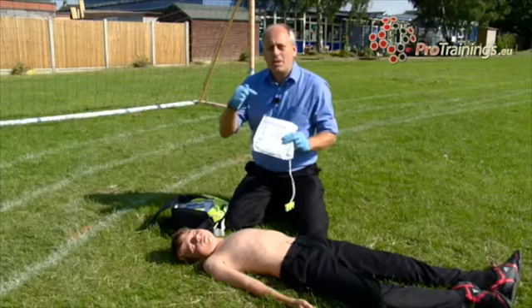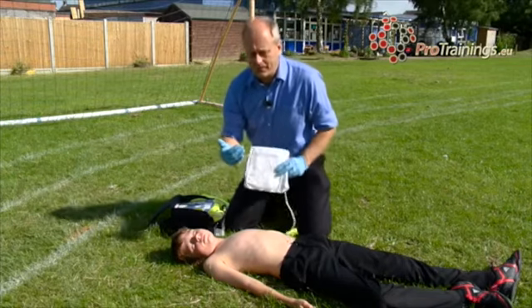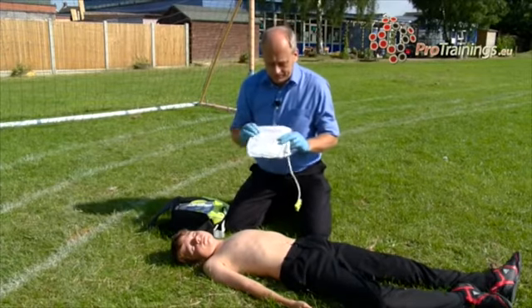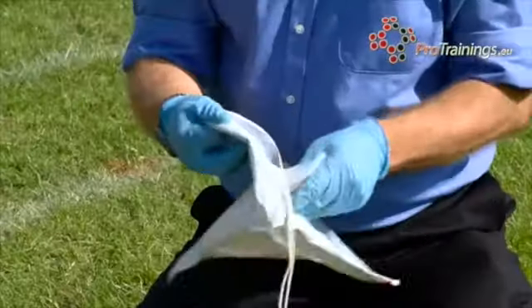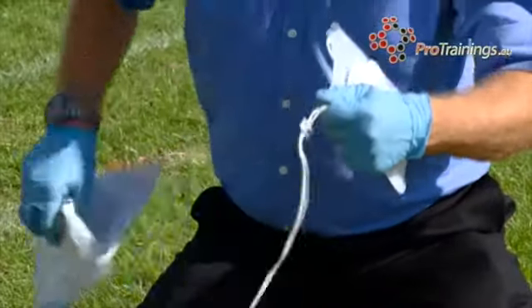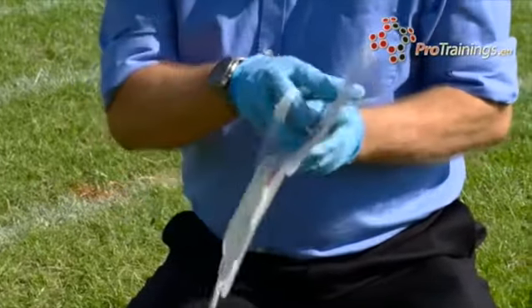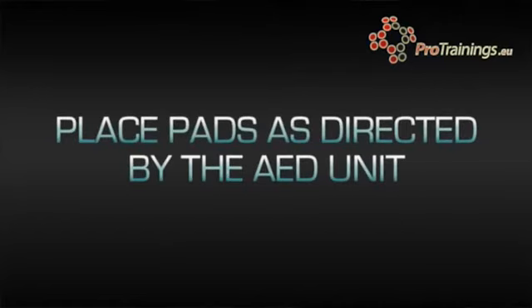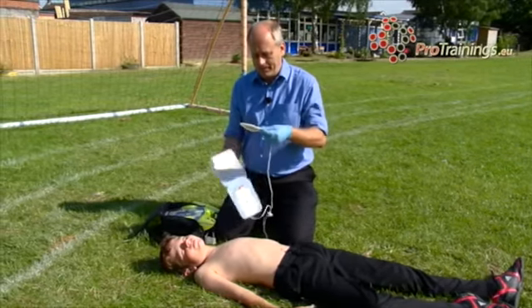But with the child, we're putting it front and back. So one to the front of the chest and one onto the back in the same position. The reason we're doing this is because we're getting better shock across the heart that way. So what we need to do with the pads is open them up. When you've opened them, you can see the actual pictures of exactly where the pads are going to go. So with these pads, you've got a little red tab here, and there's a piece of cardboard on the back. And we need to peel them away from the liner. So we're just pulling it away.